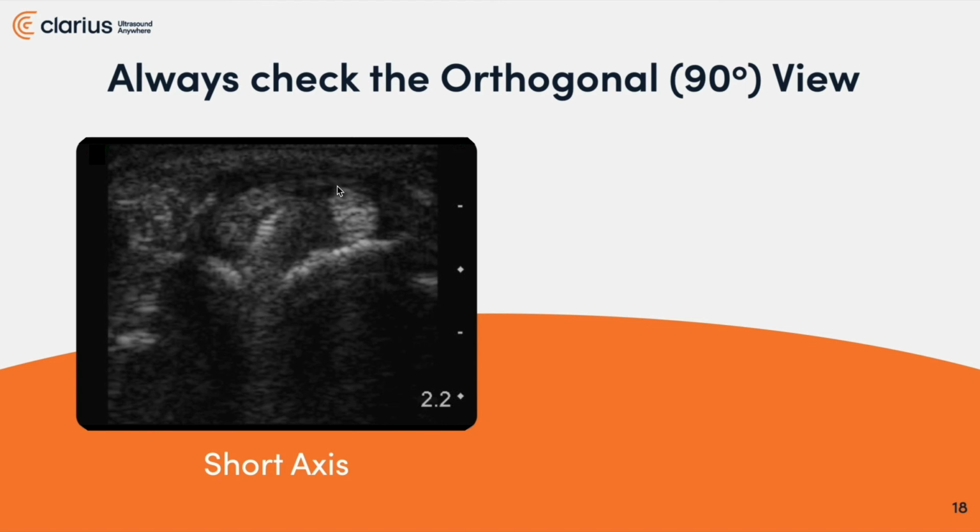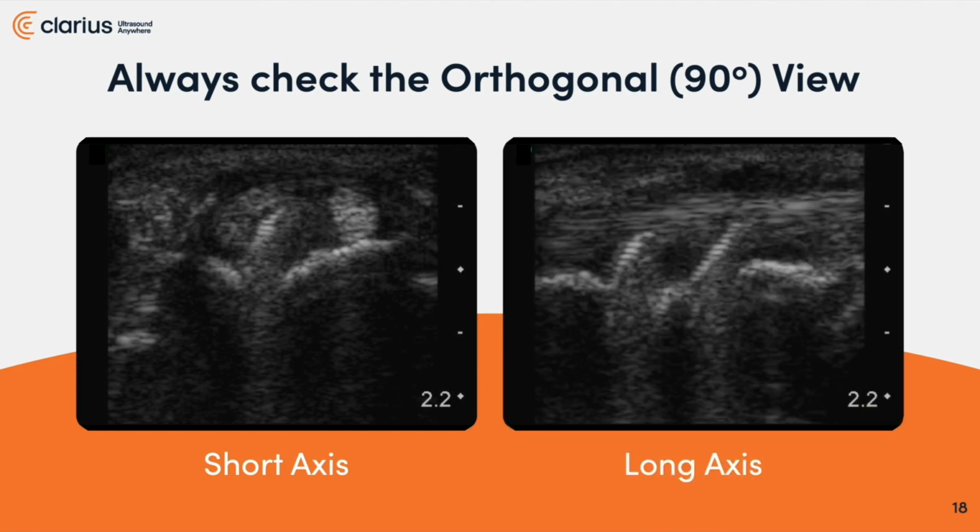We had some fluid accumulation around here, but what really began to throw me was this bright area here with what looked like ring down. And if you remember that term before, it was related to hardware. So I decided I would turn my scanner on that particular point, and this is what I saw.